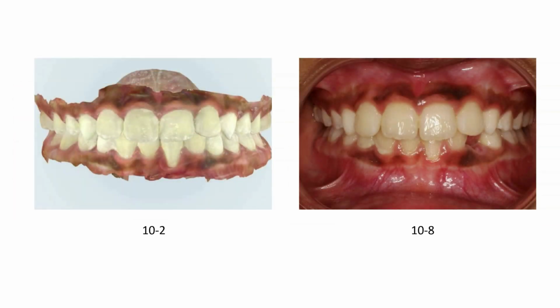When reviewing the soft tissue improvement, the end of phase 1, and 6 months later, you can see how her gum tissue has healed in that time. This condition would have actually worsened if she had not been treated during phase 1 to resolve the traumatic occlusion and the anterior crossbite.